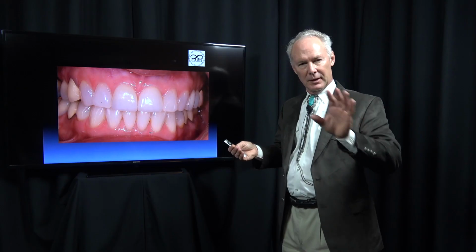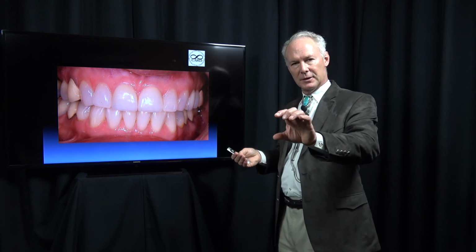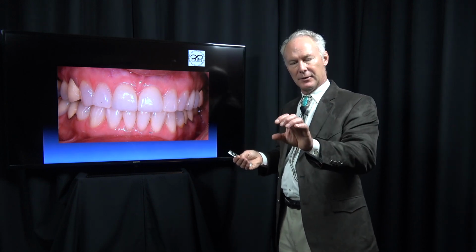Now, one of the keys is you want the porcelain veneers to be very close when they're delivered from the lab and you're trying them on the teeth. If there's a big discrepancy in shade, take a photograph of those veneers in place, take another photograph of the stump shade, email that to your laboratory technician. Be sure you have a fantastic camera.